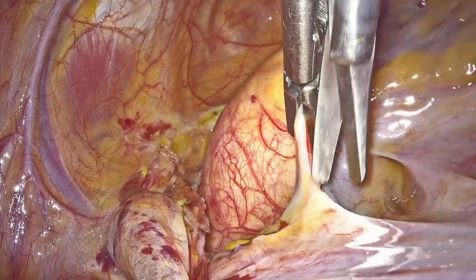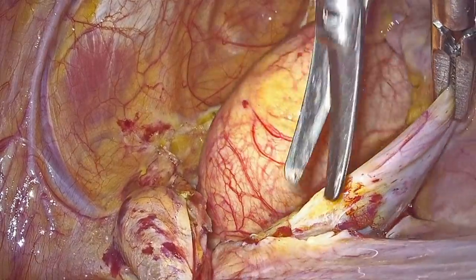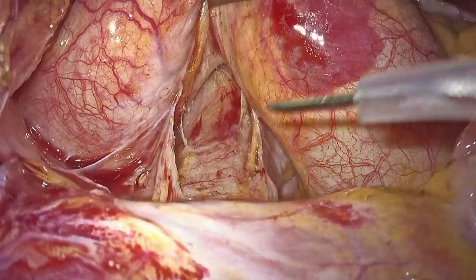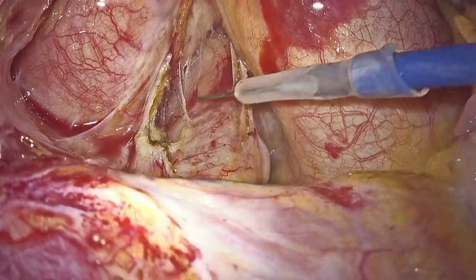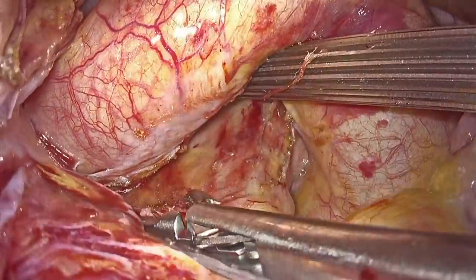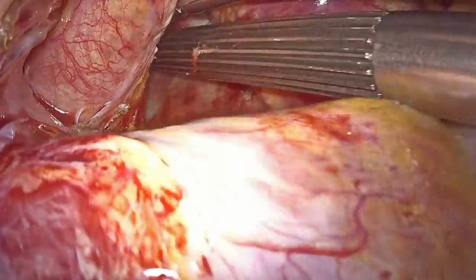We dissect the first 3 cm of the SVC in order to facilitate exposure of the left atrium. Following that, we dissect the ascending aorta free from the right pulmonary artery using diathermy and also gentle dissection with the scissors until we reach the pericardium from the other side of the aorta, from the left side of the aorta.